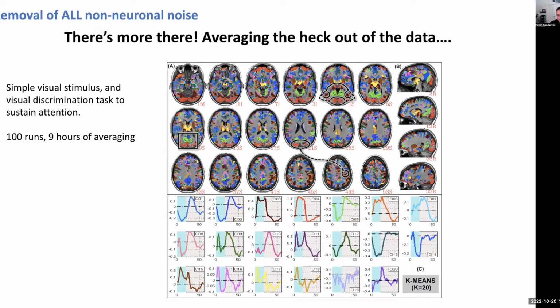And so what we found was certainly well-behaved responses, but interestingly, if we did a completely open model, allowing for all different types of responses, and this isn't saying that the hemodynamic response is different. It's the neural activity that is time locked, but it doesn't behave as you would expect. So almost the whole brain is active, and certain parts of the brain towards the base of the brain have very different responses.